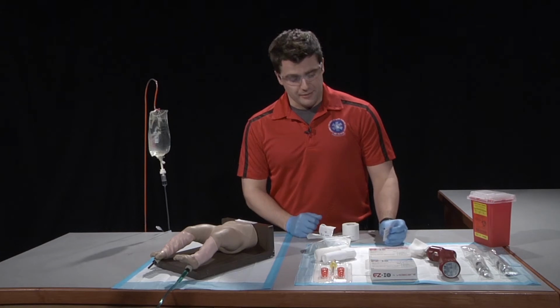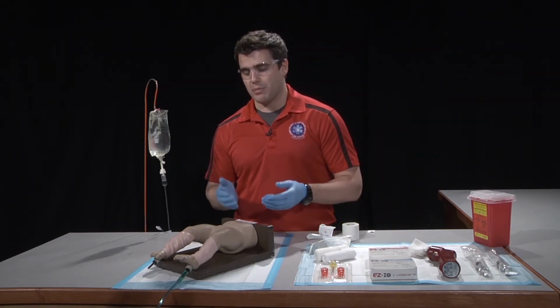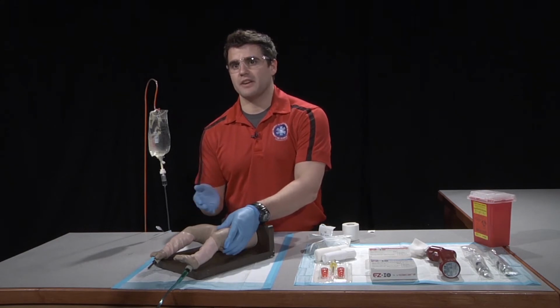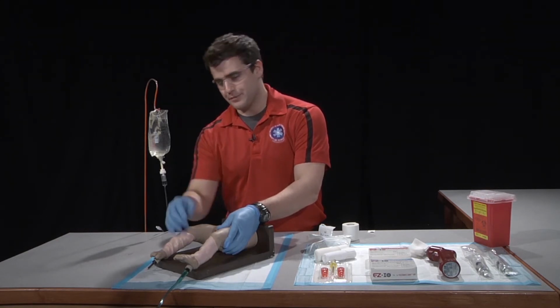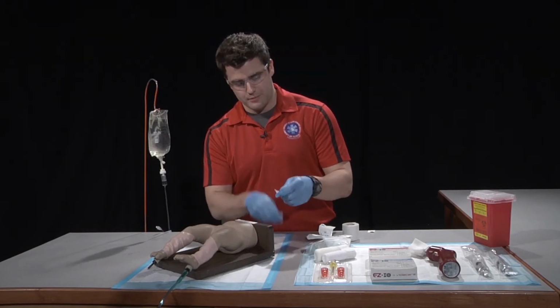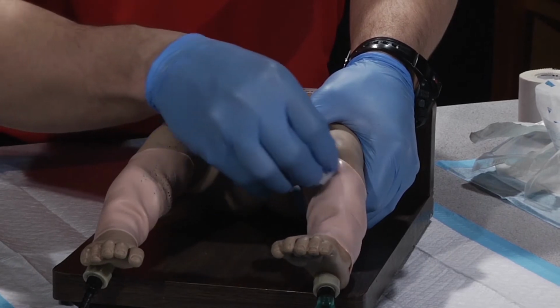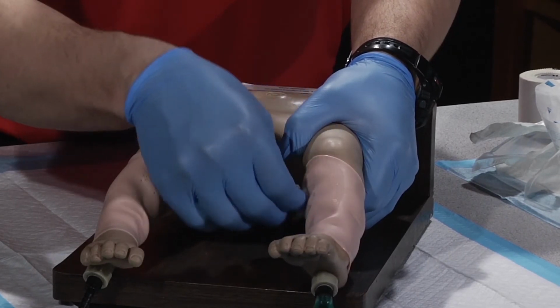We're now going to choose the appropriate anatomical site for the IO puncture, which in this instance will be inferior to the tibial tuberosity, right here. We're going to take our alcohol swab and clean the site in a circular motion moving outward using aseptic technique.